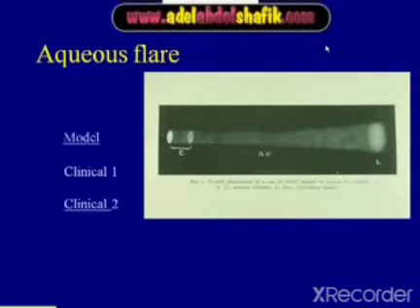Aqueous flare is another thing that you can find in the anterior chamber. I want to start by showing you this model.